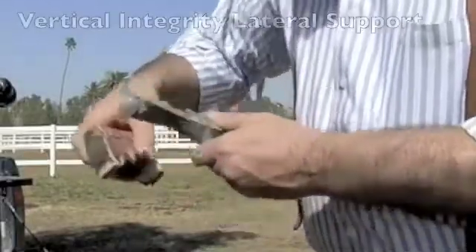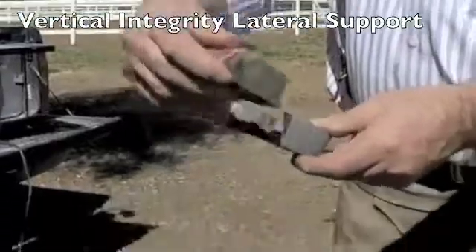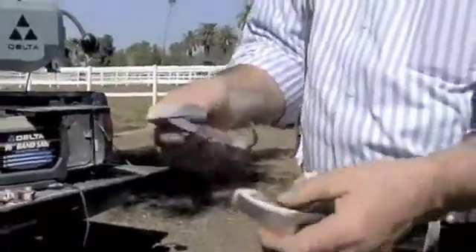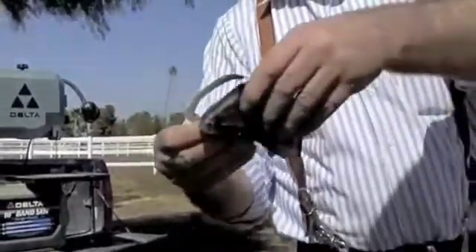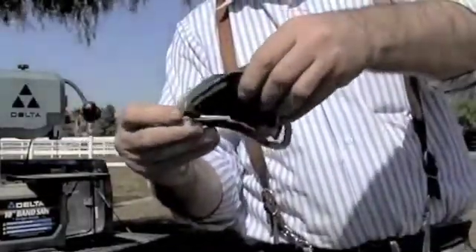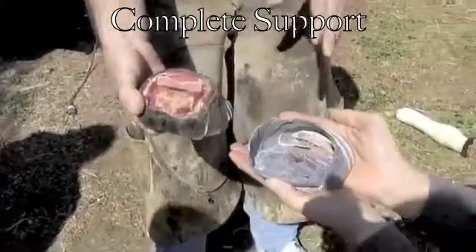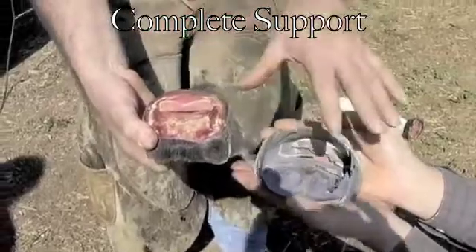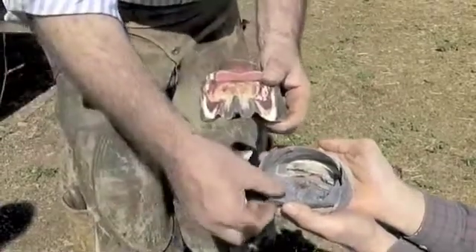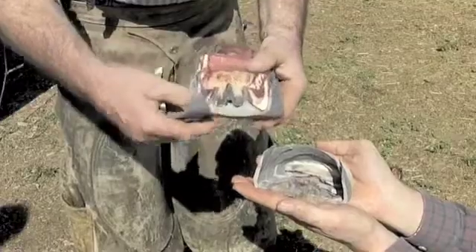When we take this off we've got a beautiful contour of the bottom of the foot. We're adding support through the walls medial-laterally and support coming up from the ground — a perfect hoof wall helping to support an imperfect hoof wall. These two are an exact model of each other. What we've done is dissipated weight over a much greater area and added stability where needed. Taking it apart, we can see the symmetry we achieved, and you can see how well the cast fits right back in.